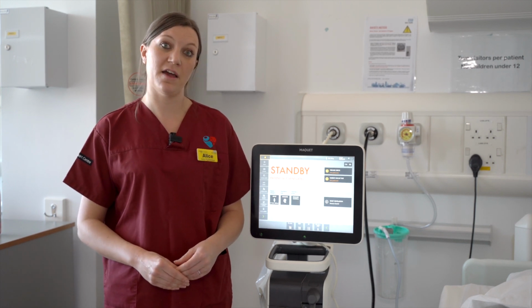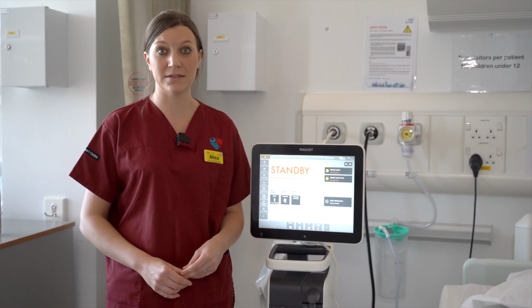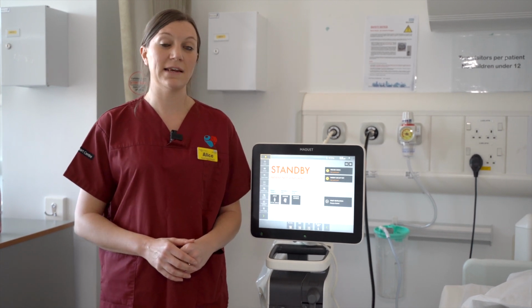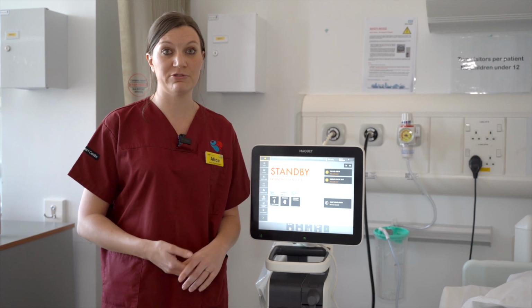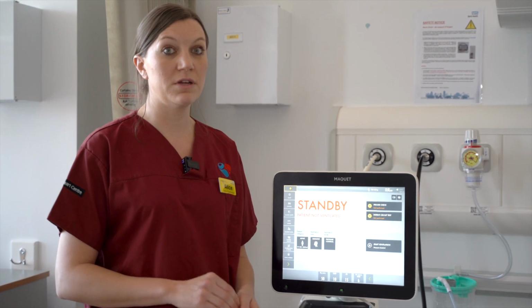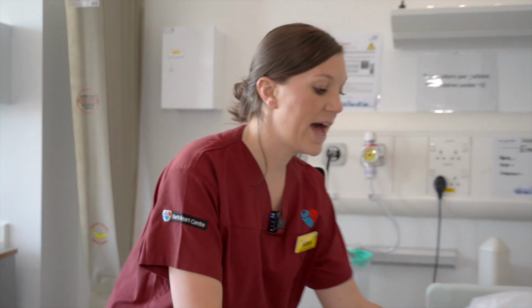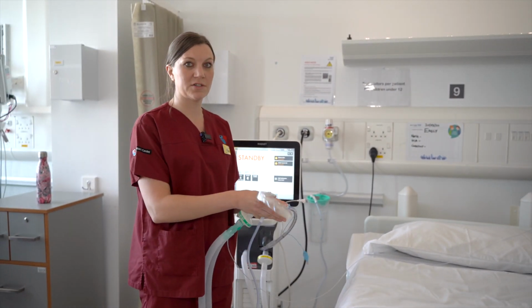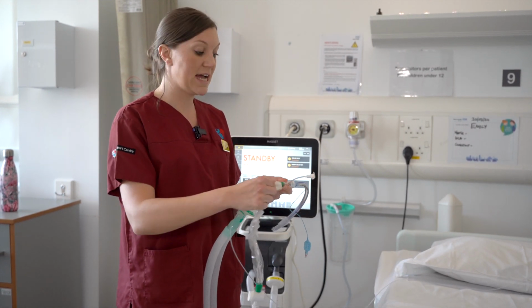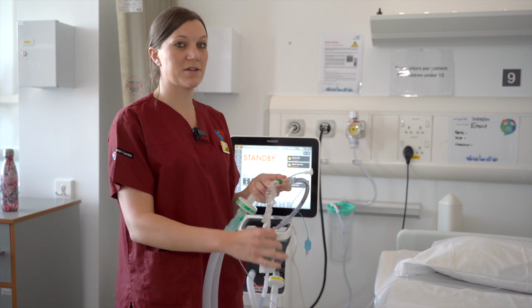Other problems that can occur is a blockage of the endotracheal tube caused by secretions or plug. In this case, you'll see a large disruption to the ventilation and a likely deterioration in the patient's respiratory parameters. In order to identify this, it's important to attempt to pass a suction catheter down the endotracheal tube. As before, you will use your closed circuit suction. Make sure that it is open and feed the suction catheter down through the endotracheal tube. If there is a block, you will not be able to pass the suction catheter down.